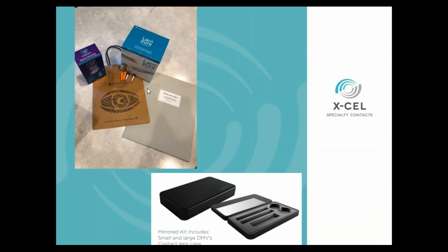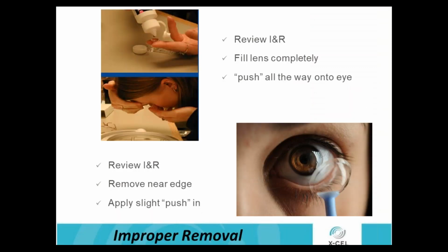And what we've developed is a nice little care kit that the patient can have, where we can fit in the DMVs and a lens case. It has a mirror and you can fit unpreserved saline in there. So the patients are never without the ability to remove that lens and then reapply that lens. It really helps, again, with that forefront thinking and not getting to a troubleshooting point with those patients. So as much as we can do for them to comply. Insertion and removal is one of those things: repetition, repetition, repetition, observing that to make sure they are properly doing it.